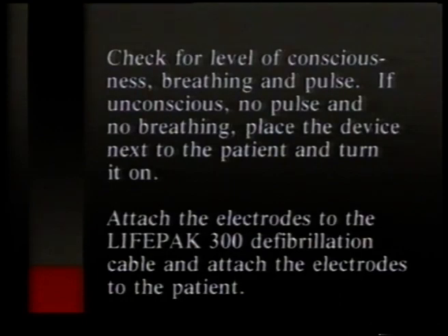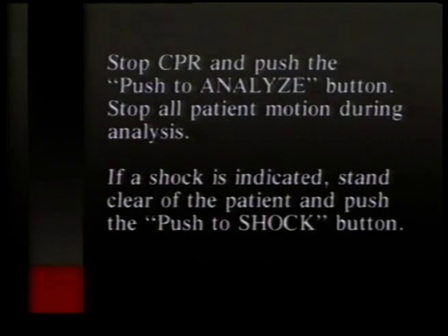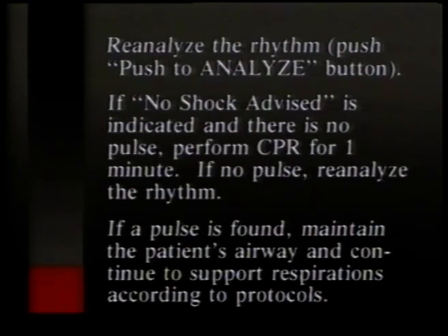Let's review the highlights. Check for level of consciousness, breathing, and pulse. If unconscious, no pulse, and no breathing, place the device next to the patient and turn it on. Attach the electrodes to the LIFEPAK 300's defibrillation cable and attach the electrodes to the patient. Stop CPR and push the Push to Analyze button. Stop all patient motion during analysis. If a shock is indicated, stand clear of the patient and push the Push to Shock button. Reanalyze the rhythm. If no shock advised is indicated and there is no pulse, perform CPR for 1 minute. If no pulse, reanalyze the rhythm. If a pulse is found, maintain the patient's airway and continue to support respirations according to protocols.